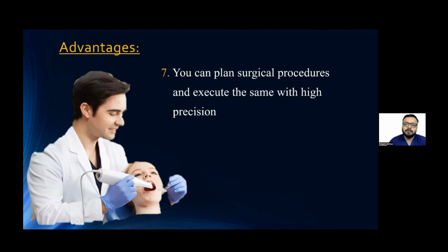And of course, you can plan your surgical procedures, you can do guided surgeries with very high precision, and you can give your prosthesis on the same day itself.